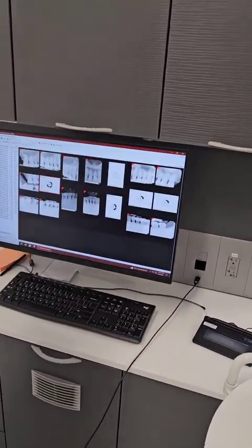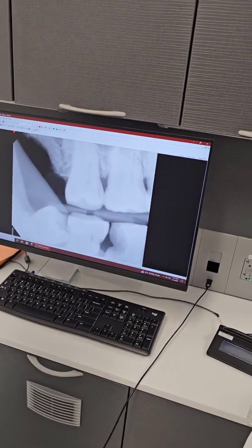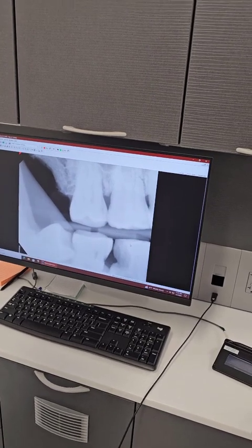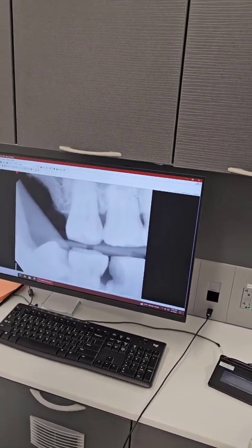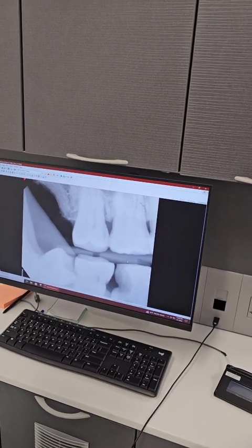This one was a little far distal. That contact was great. I did capture some of the crown of that impacted third molar — a little overlap there. Sometimes you'll open that up in the premolar. If I'm being critical, I'd say I also captured a little too much of the maxilla rather than the mandibular bone.